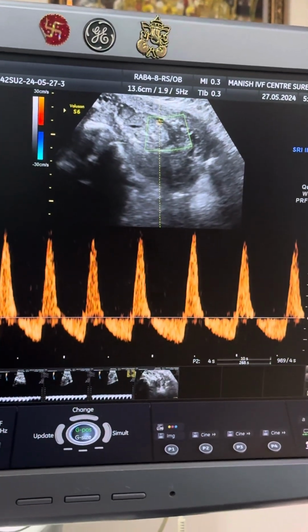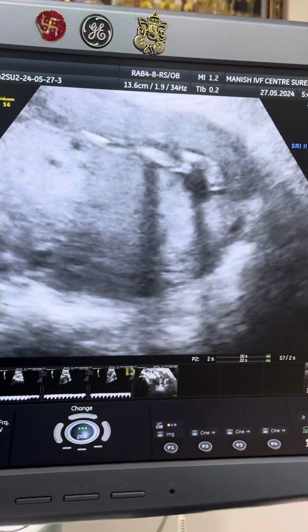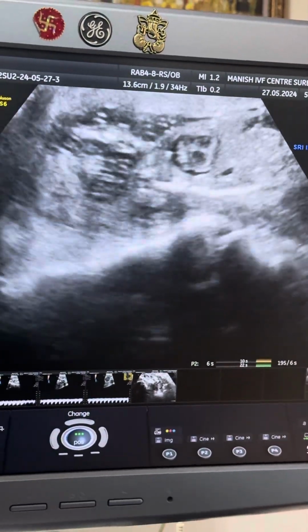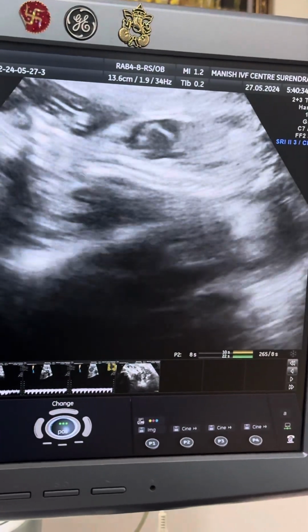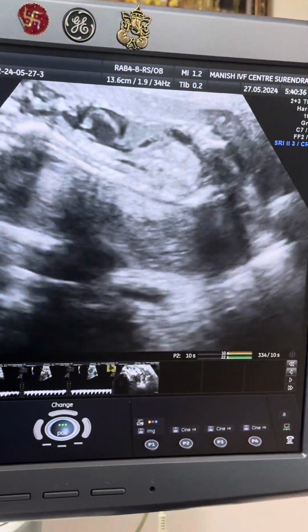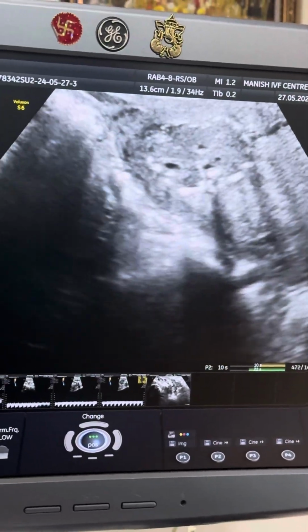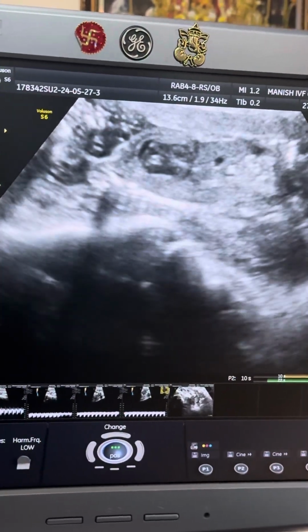This shows abnormal pattern of reversal. Absolutely no liquor. Severe oligohydramnios. Even stomach bubble is not filled one because patient has got no liquor to drink. Stomach bubble is seen but very flattened one.